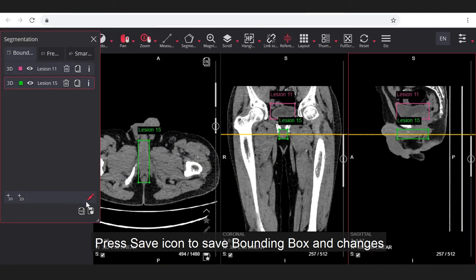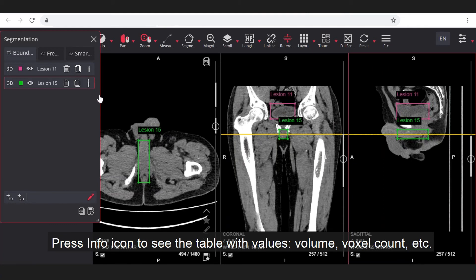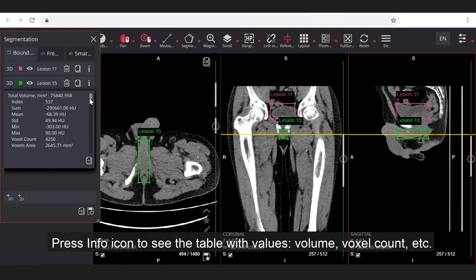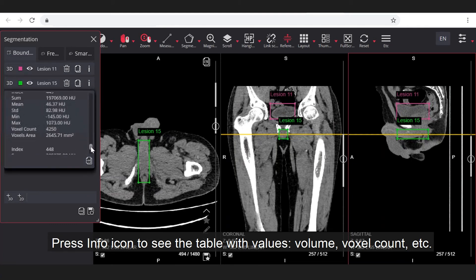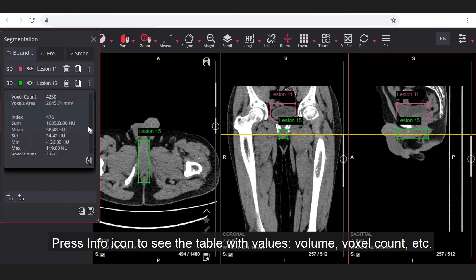Press save icon to save bounding box and changes. Press info icon to see the table with values: volume, voxel count, etc.